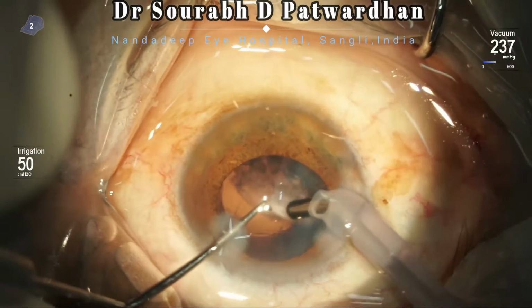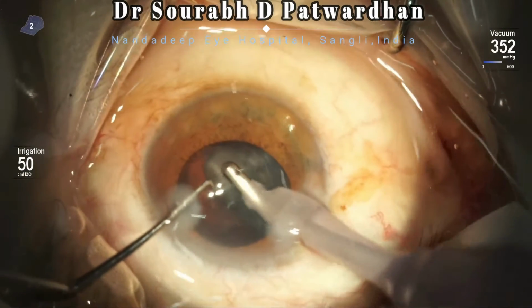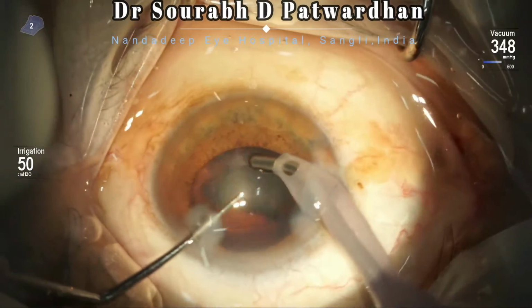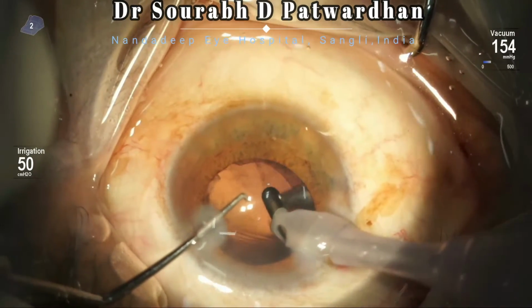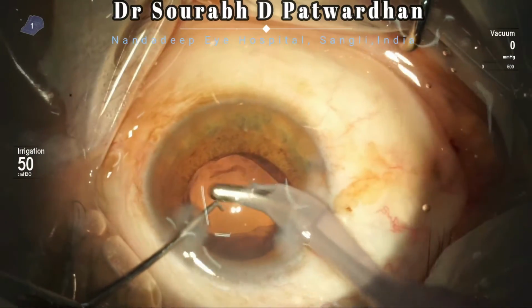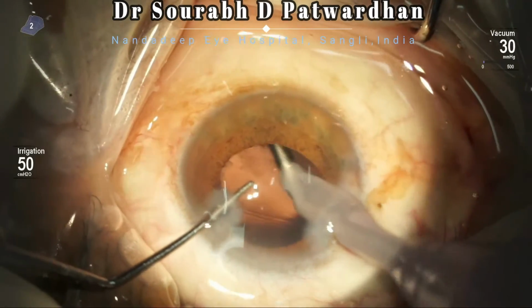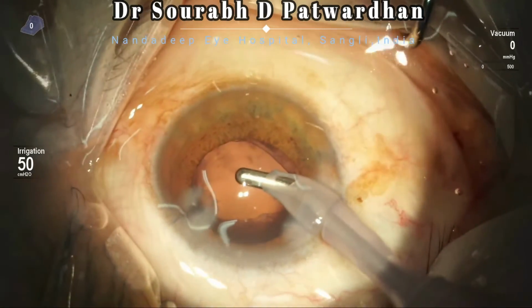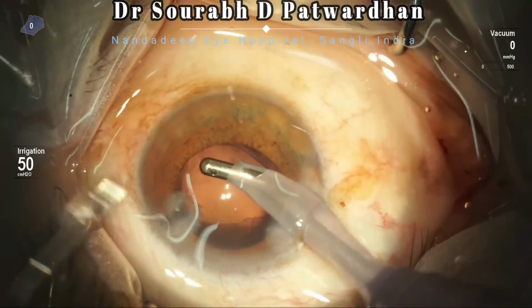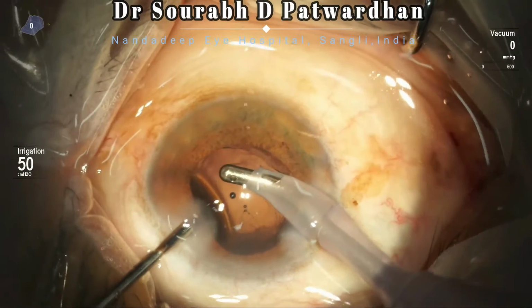While you are near the capsular tags, be careful that you are not holding the capsular tags. Just allow a moment to realize whether you are holding the cortex or the capsular tag. In such cases, avoid excessive peripheral polishing because you may catch hold of the capsule anytime and tear the posterior capsule. Again, while withdrawing the probe, remember you have to avoid fluctuation in the anterior chamber, which may allow the anterior capsular rupture to rip behind.